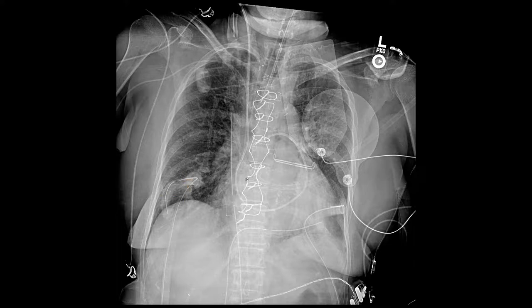What's this big round thing here, and the almost rectangular one? These are external pacing pads. After surgery, they'll often have these in place until the patient's own heart can beat for itself. They may be used to get the patient through surgery for a few days before a permanent pacemaker is placed.